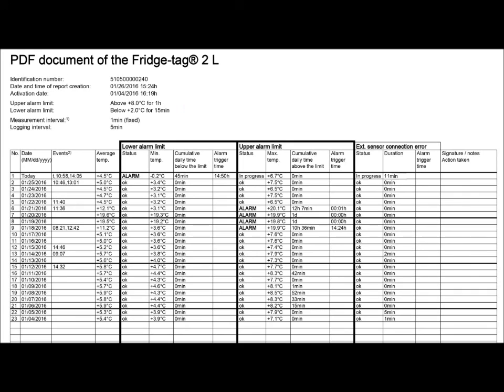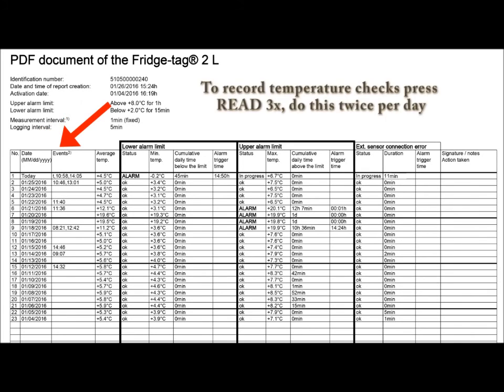Going from left to right we see the current date. In the events column we see actual times when the read button is pressed to check the high and low temperatures, and those must be checked twice a day.